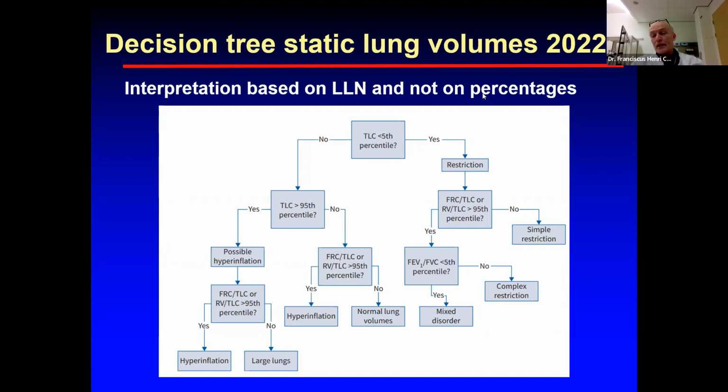And the same we, for instance, do for the airway geometry. If you go for a CO diffusion, what CO diffusion can you use then? Well, we can go even back up to 3 months, because if you don't have a disease which influences your CO diffusion, you might still use that CO diffusion for the decision tree of your airway geometry. But that would be a totally different webinar.